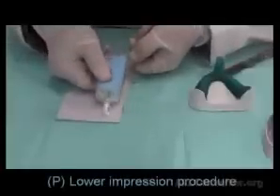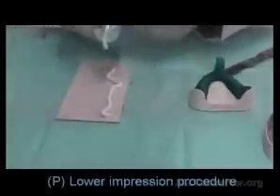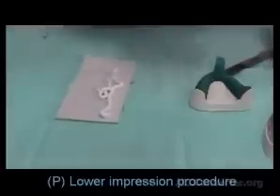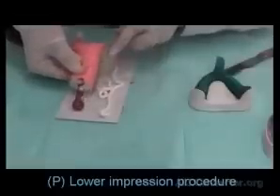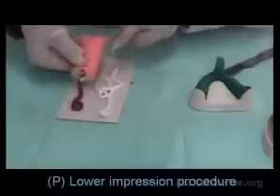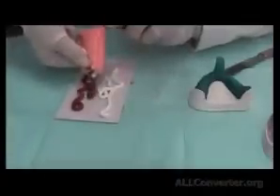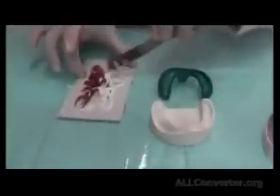For the lower, I'm going to extrude the material in lines. Want sufficient material. Gather the material together.